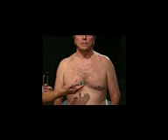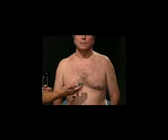I'm going to listen to your lung sounds, and I'm going to use the diaphragm of my stethoscope to listen to those sounds. Your lung sounds are higher pitched in nature, so the diaphragm helps me to hear those sounds better.